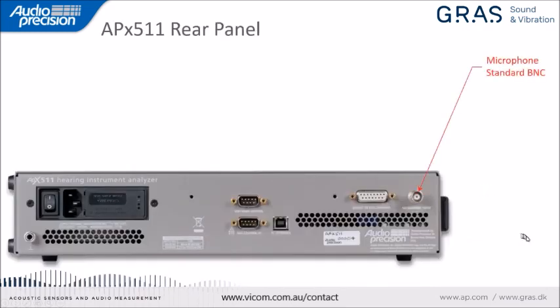On the back panel, we have a standard BNC input for the microphone signal. And then we have this 15-pin D-sub connector, which is used to convey the output to the speaker in the test box, to the telecoil loop, and also the battery simulator.